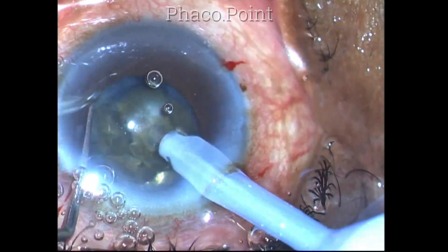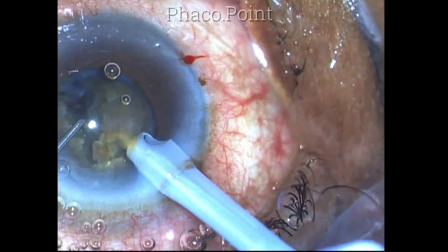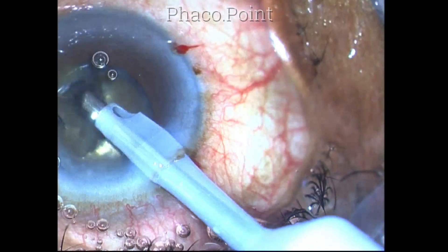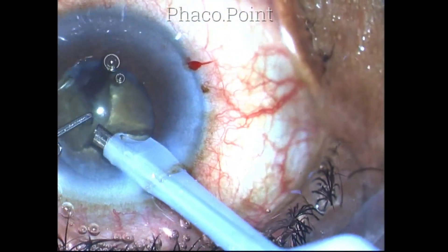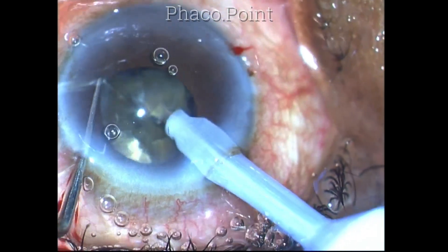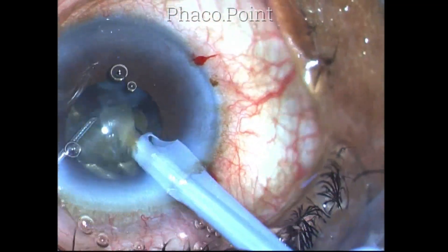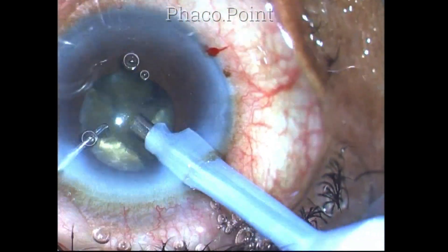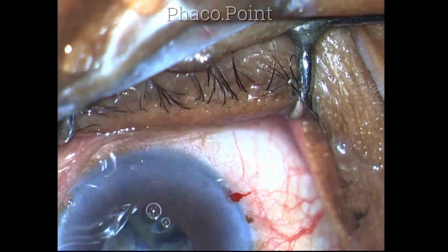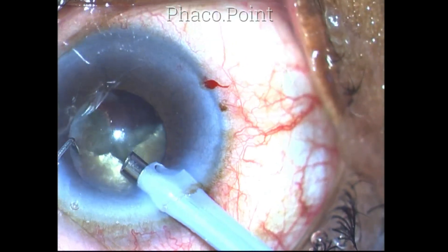Once having broken up the nucleus into sufficient smaller pieces, I remove each piece by bringing it to the center and emulsifying it in the multi-burst mode of phaco emulsification. Note that dispersive viscoelastic like Viscoat or chondroitin sulfate is not used in this case — I'm using simple methylcellulose only. If you stick to breaking the nucleus into small pieces and emulsifying in the center, you can achieve sufficient endothelial protection and safety.